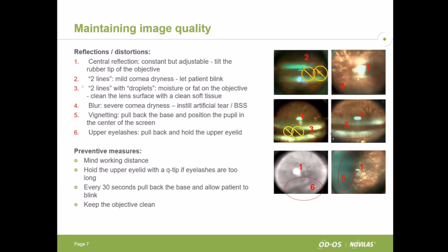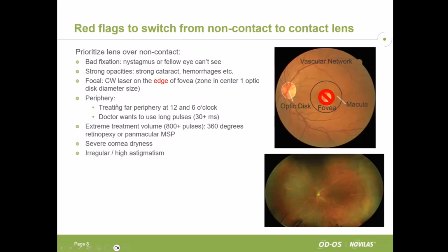Take-home message. Learn to keep the working distance. Don't neglect holding the upper eyelid. Do everything to keep the objective clean. Let the patient blink every 30 seconds to make sure the cornea is not dry.